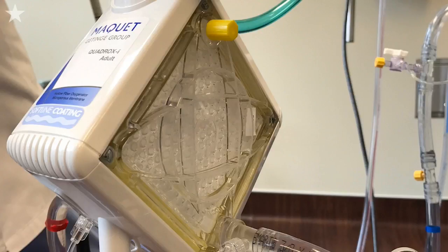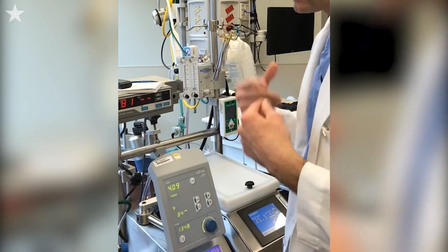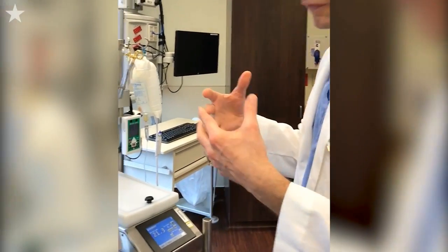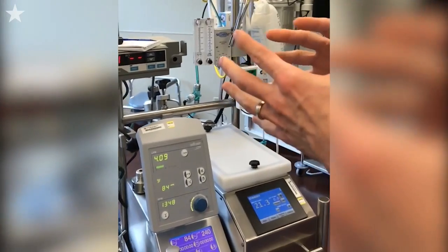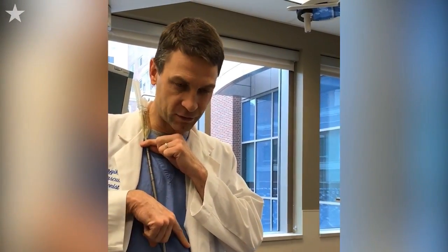We're going to bring the oxygenated blood back. We can determine how much oxygen is in it — room air is 21%, and then we go up to 100% oxygen. That oxygen then flows to the lung. As long as we have this in an exact position and it doesn't get manipulated at all, and we check this daily to make sure it's there, we get perfect jet into the heart.